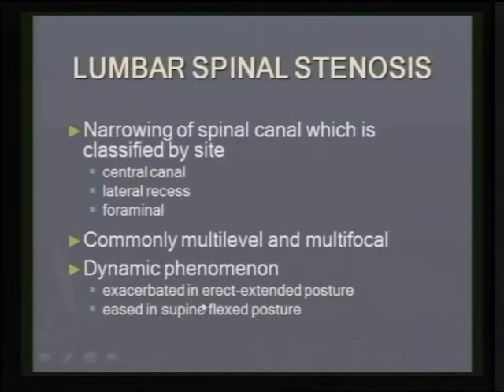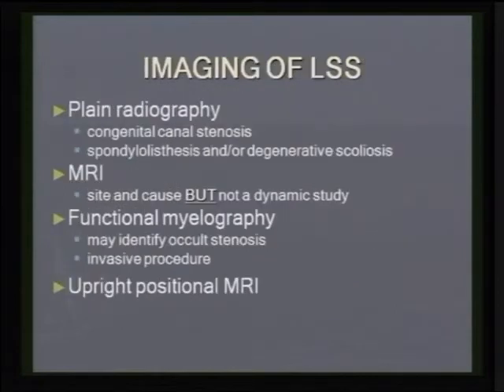And of course, the supine flexed posture is a position that we routinely image patients in at lumbar spine MRI. So potentially, lumbar spine MR can miss clinically relevant spinal stenosis.